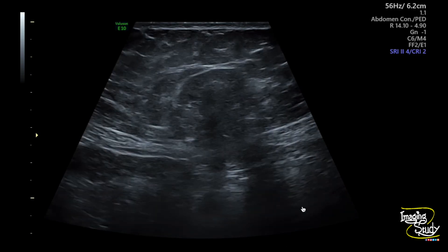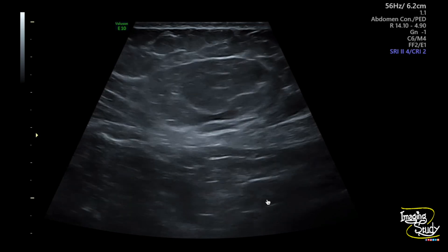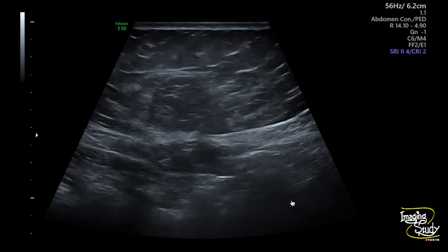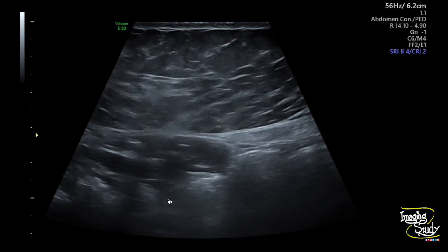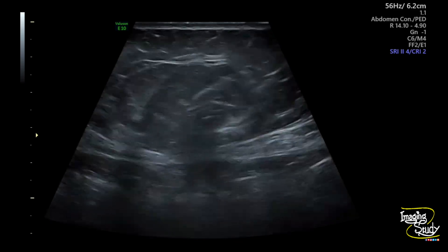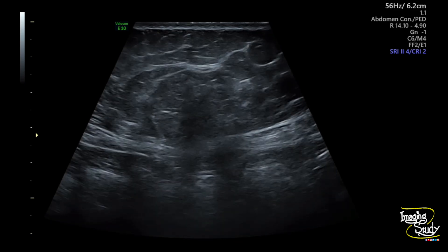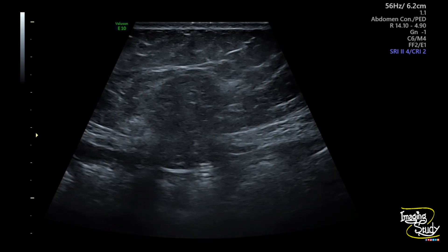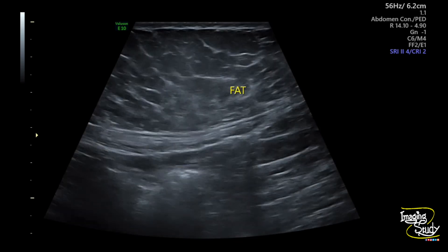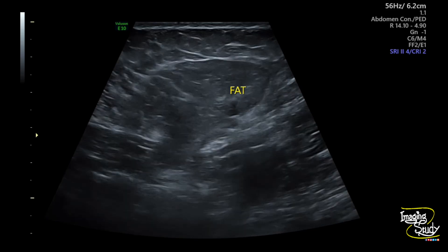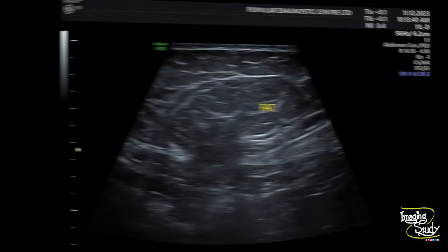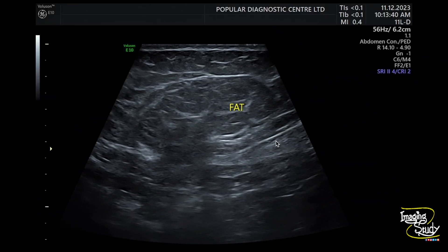You can see bowel movement here, but the bowel didn't come into this sac during coughing. Here you can see the gap at the midline and the herniated omental fat coming to the subcutaneous layer.